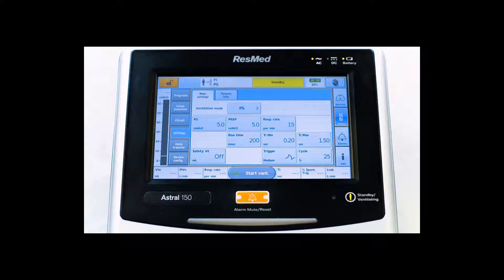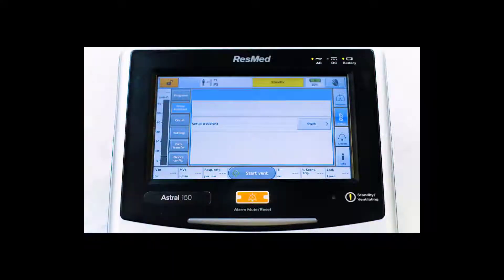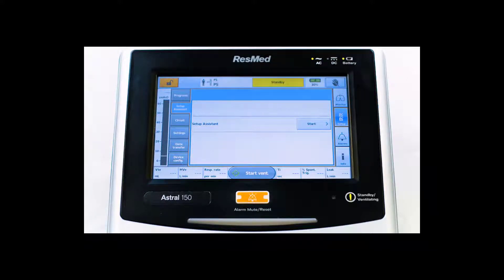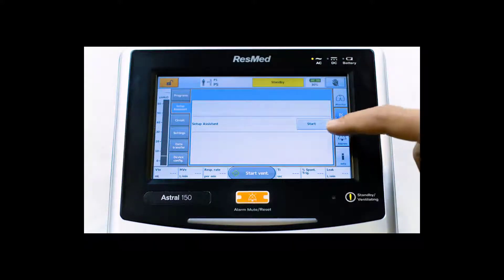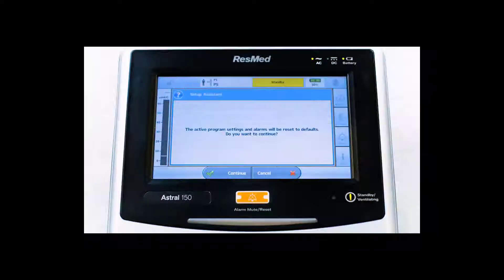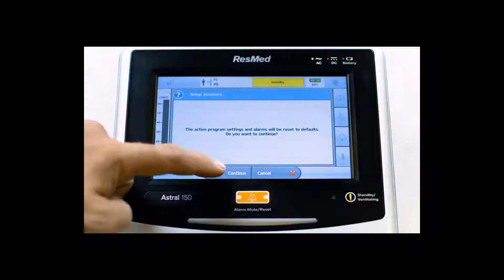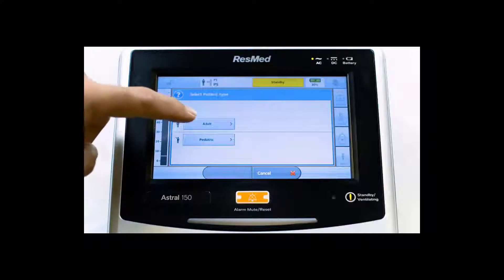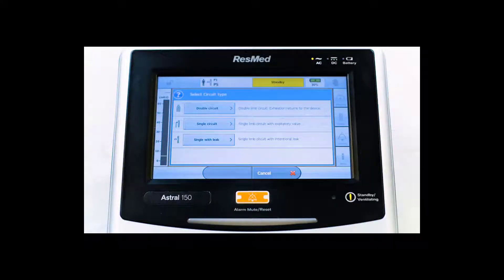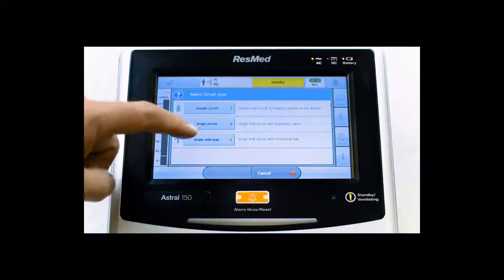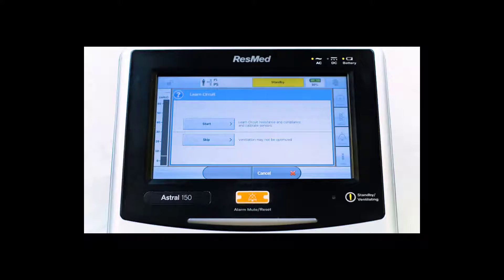Please note, the Setup Assistant guides you through the process of setting up the device for use by a new patient. Select Start to run the Setup Assistant. Running the Setup Assistant will reset the settings to default. Select Continue, then select Adult. For the circuit type, select Single with leak. This will prompt the learned circuit. Select Start.